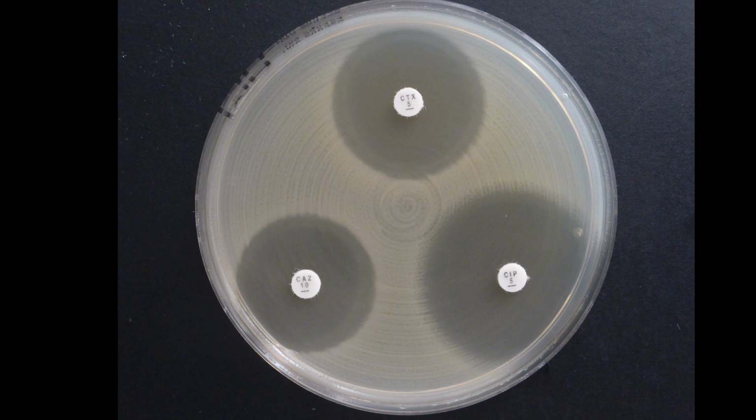But we started to look into, could we harmonize even further for some of these agents that are a little bit more difficult to read? The first ones we looked at were erythromycin, clindamycin, and fusidic acid, which usually have fuzzy zone edges. So we went back to the reading guide, looked at the instructions, and reminded everyone about holding the plate about 30 centimeters from the eye.